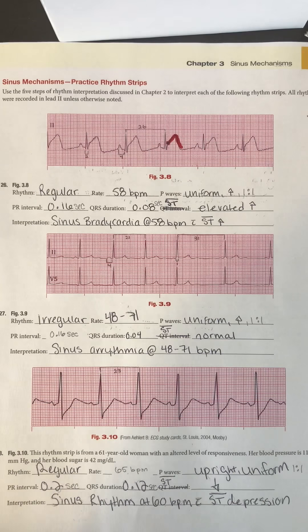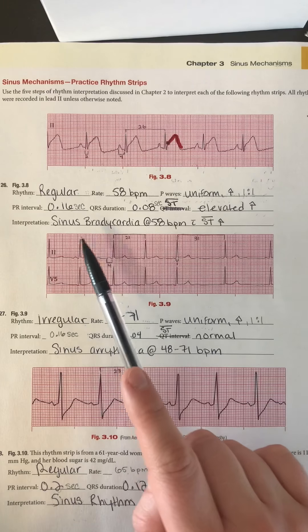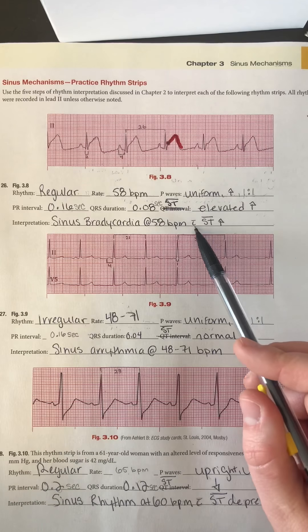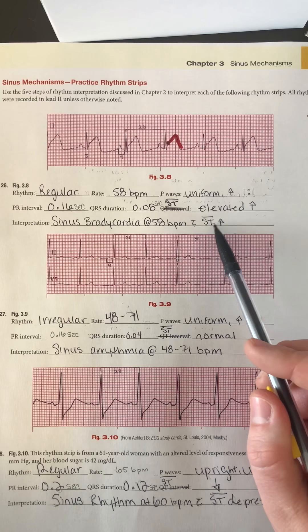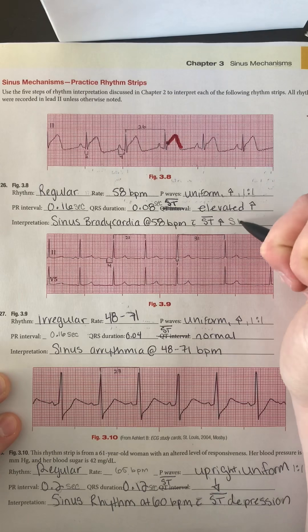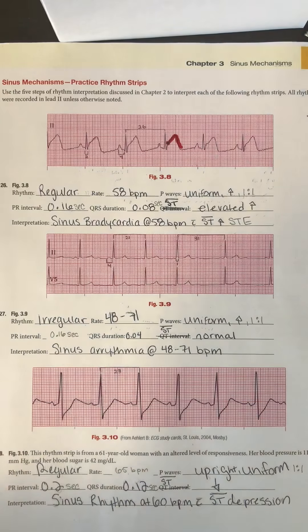So the name of this first rhythm is sinus bradycardia at 58 beats per minute. It's bradycardic because we're under 60. It is sinus because it is regular, we have P waves for every QRS complex, they're upright and uniform. I noted ST segment elevation — sometimes written as STE — whichever abbreviation you want to use is fine.